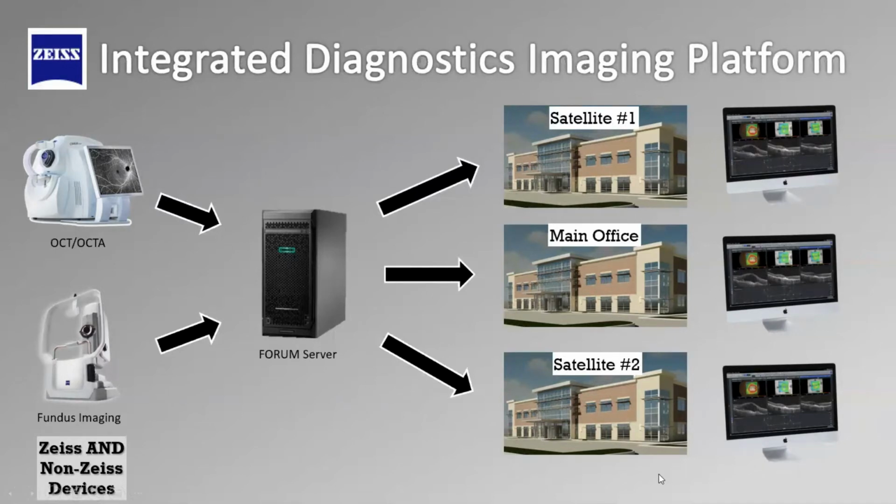You know, we have a large practice in Middle Tennessee. We have a main office in Nashville with about 8 satellites scattered throughout Middle Tennessee. And within each of these offices, there are multiple lanes. In each lane, there's a review workstation running Forum Review and Retina Workplace. And that software communicates with this Forum server to allow us to review a patient's images, interact with them, annotate them, etc. This is sort of a decision that we made as a practice many years ago, that we really value the ability to have access to a patient's entire imaging history at any office at any time.